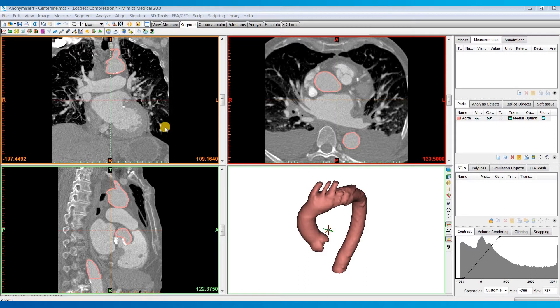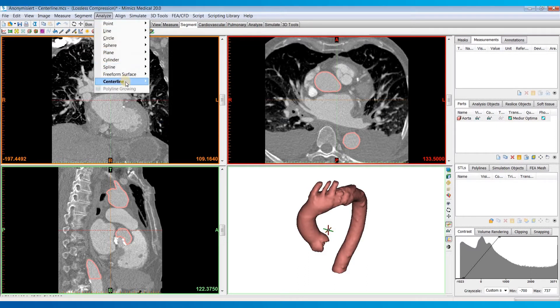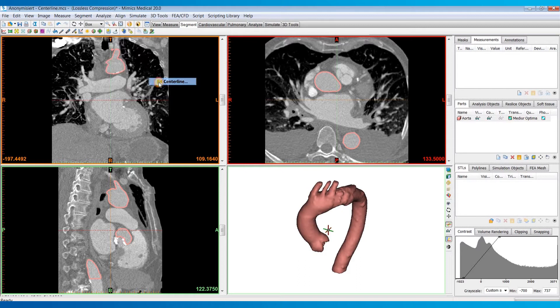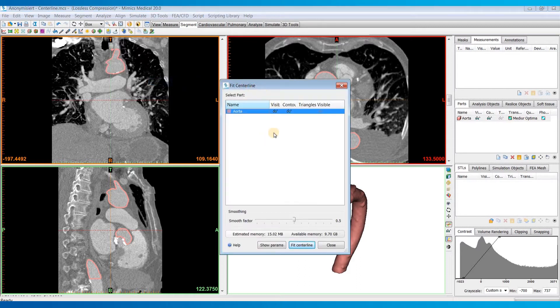But to start, I'll go to the Analyze menu, and I'll hover over Centerline, and then select Fit Centerline, which will bring up this dialog box.